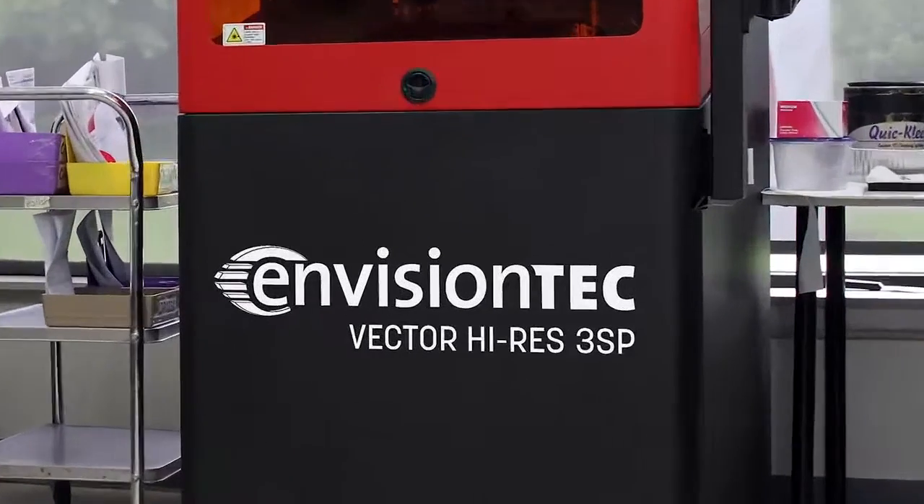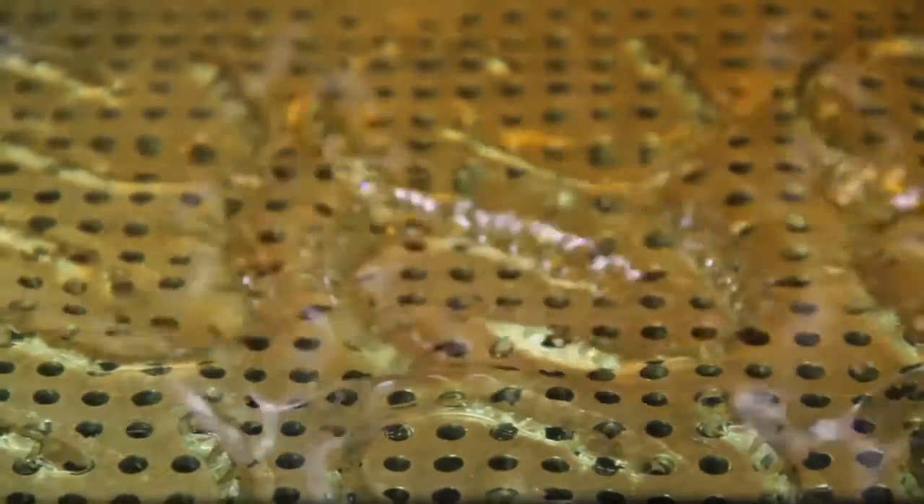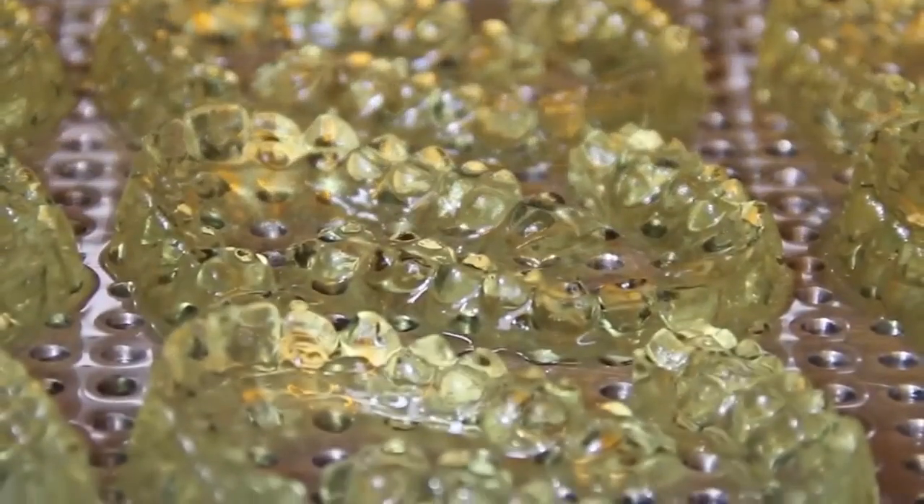We also have the Vector3SP High Res which has an XYZ resolution of 50 microns. You could print about 15 to 20 high resolution crown and bridge models on this machine in underneath 4.5 hours.